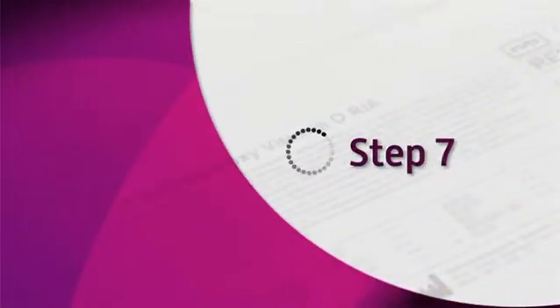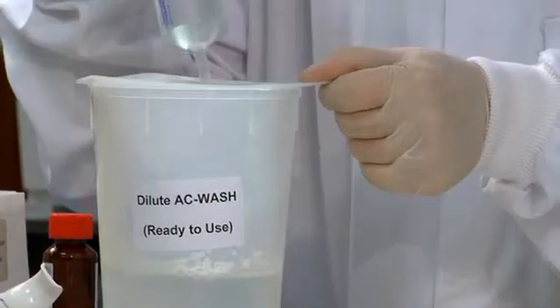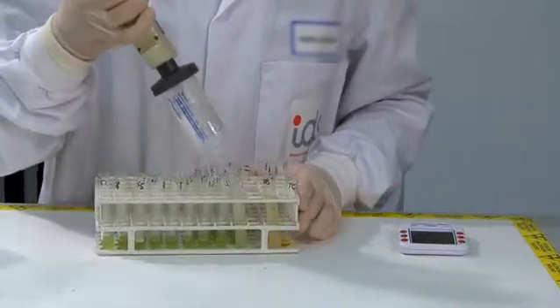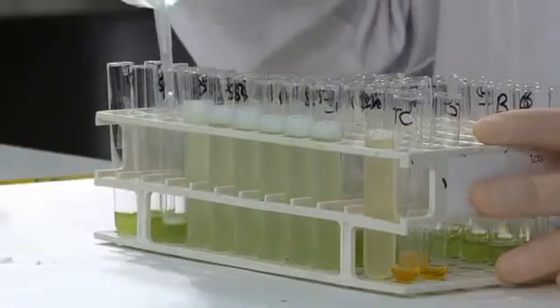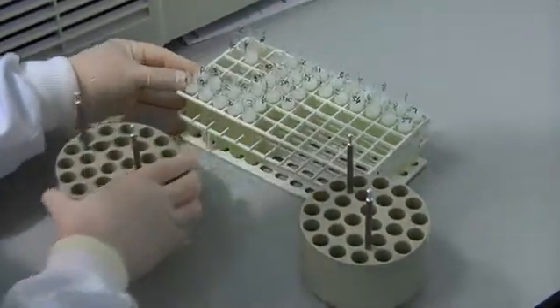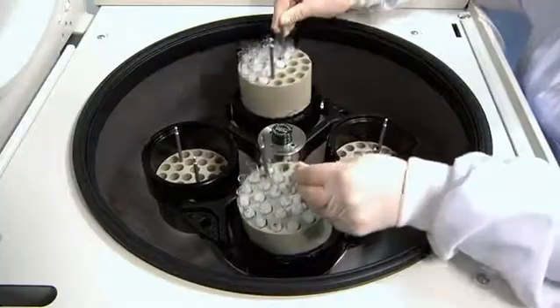Step 7: Add 4 ml of wash solution to all tubes except for total count tubes. Centrifuge all tubes except for total count tubes at 2000G for 20 minutes.